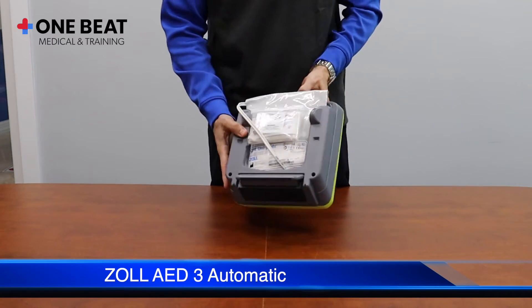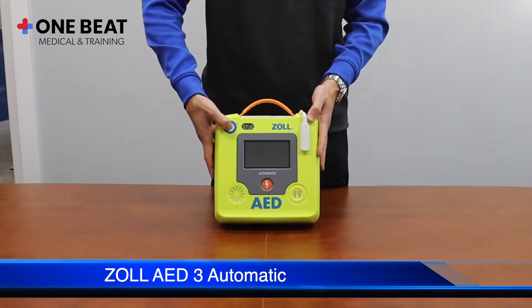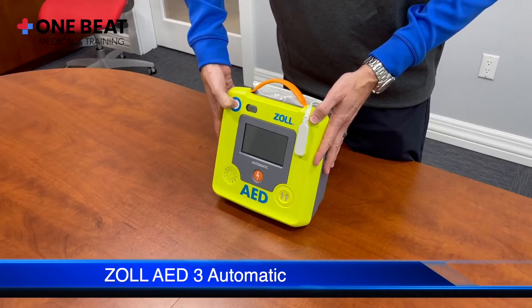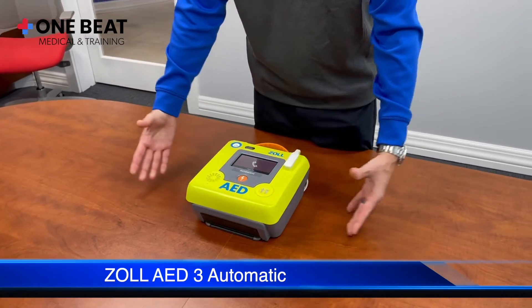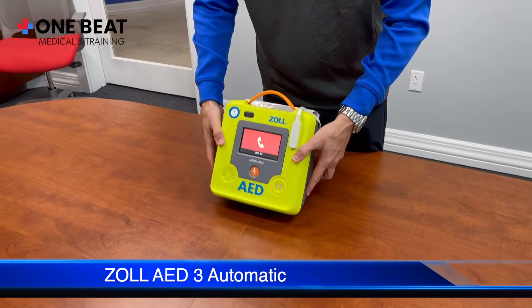The setup is now complete. Now let's see how to use the unit in case of emergency. To turn on, press the power button. This AED has a built-in feature that allows it to be placed standing up for easy access.